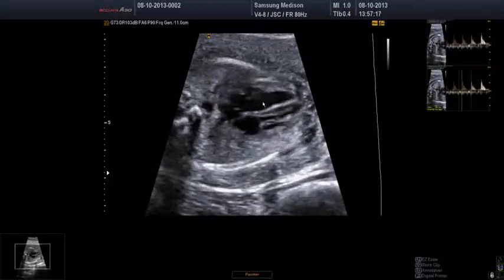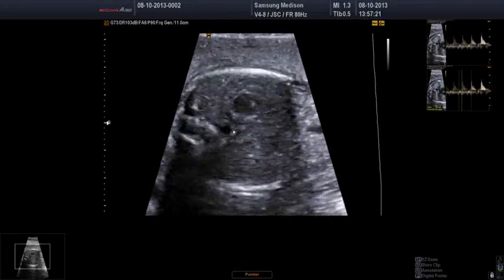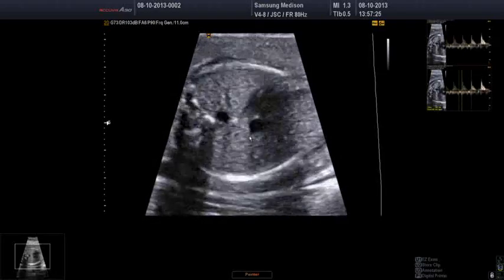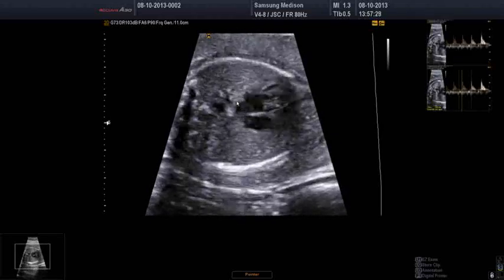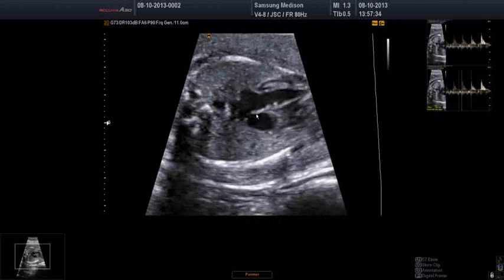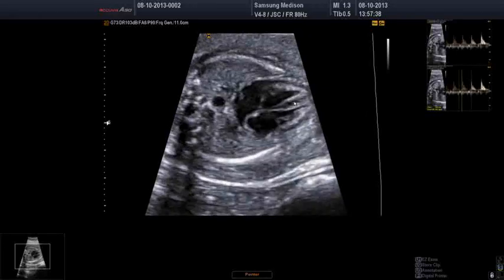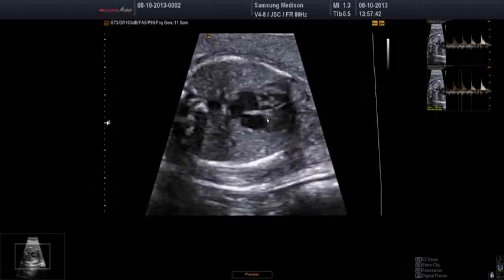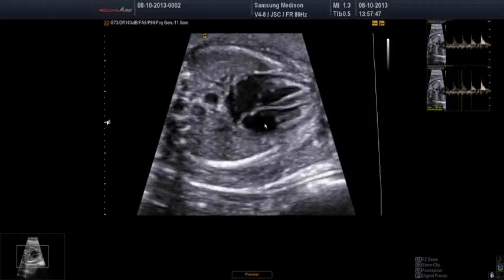So this is the left ventricle. If we start from the abdomen, the stomach is on the left. That's the aorta to the left, the inferior vena cava to the right, which tells me that the atrium on the left is a left atrium. And on that, I can see pulmonary veins coming into the left atrium, the foramen ovale with the flap valve. And we have to identify the ventricle attached to the left atrium. And you can see nicely here the offset of the atrioventricular valves.